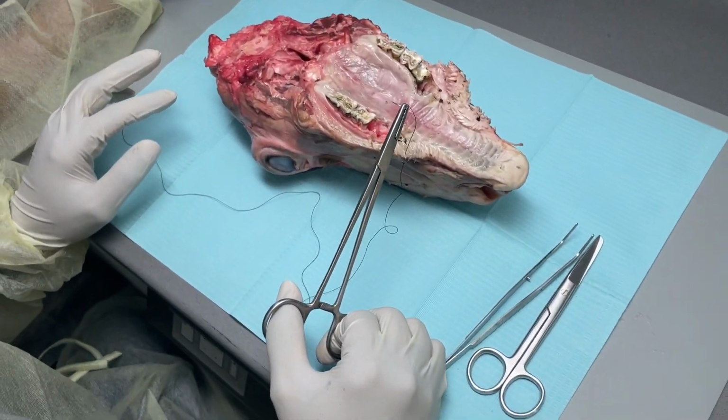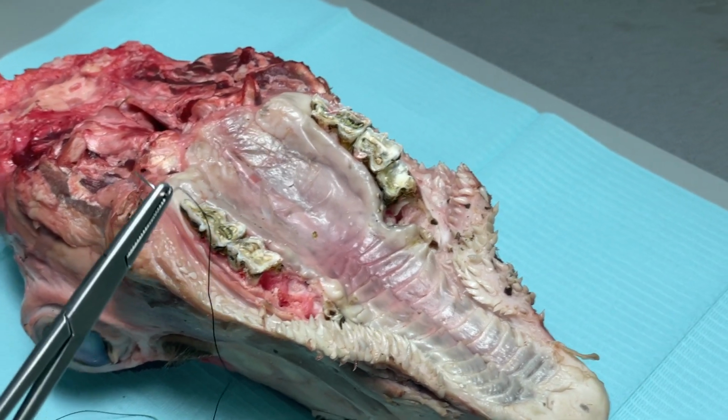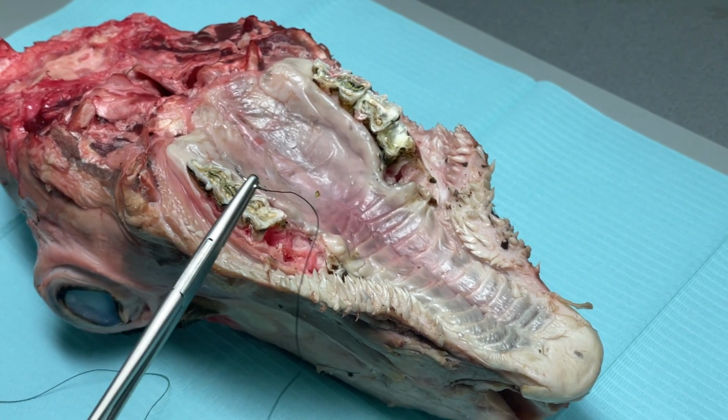Now you see, say I'm going to suture here, for example. The way I hold it now is wrong. Why? How will I place it? I cannot do it. See? No. The direction of how I held it is wrong.